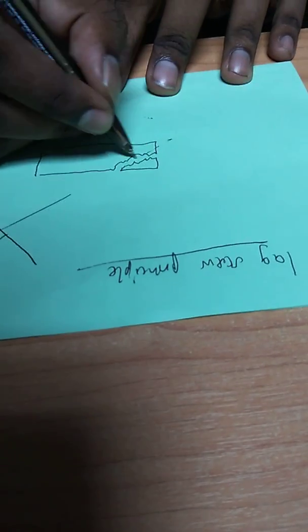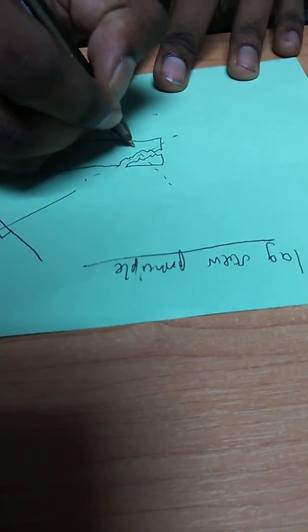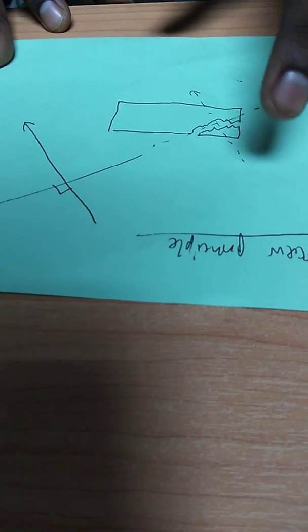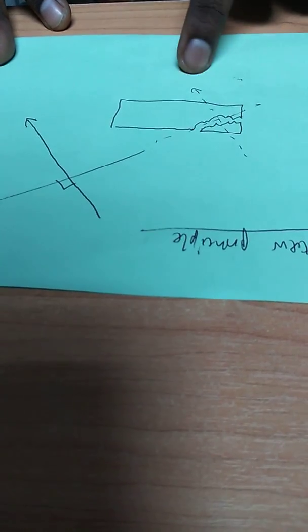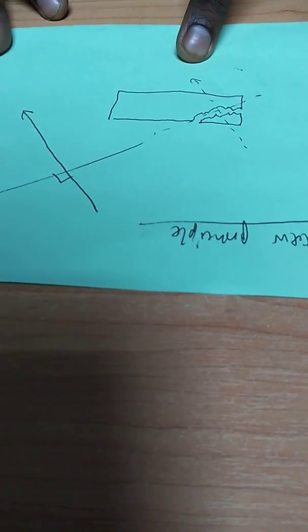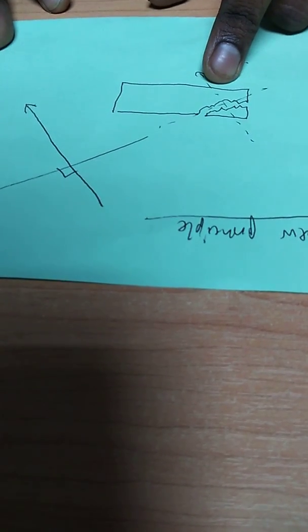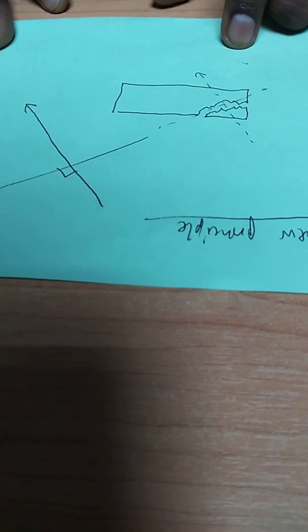So this is the fracture line. You have to place the screw in this direction, and the screw has to be placed from the smaller bone to the larger bone. Okay, smaller bone to the larger bone, perpendicularly at the fracture site. Okay, how do you do it?